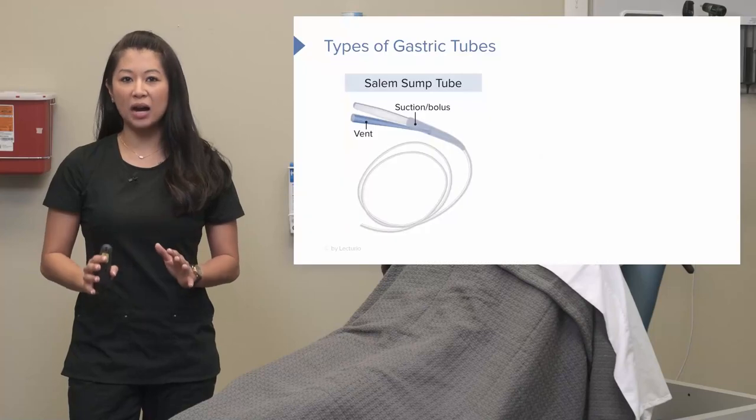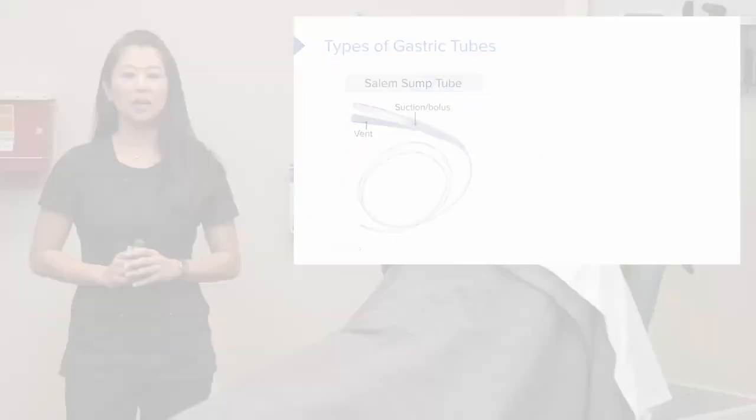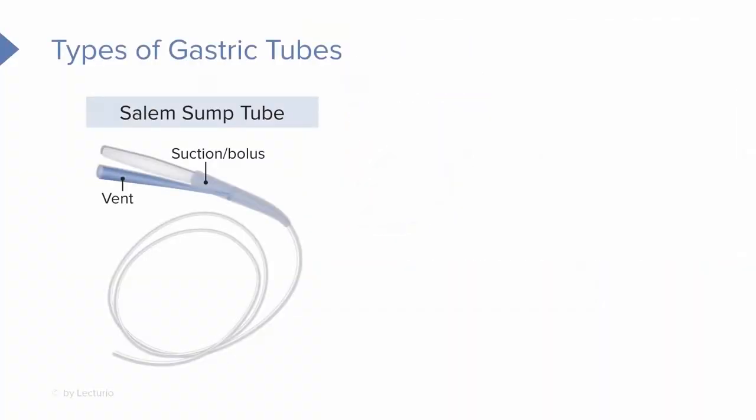Let's take a look at some common types of gastric tubes. The first one is commonly called a Salem Sump Tube. On this device, you can see there's a blue vent port, and also a suction or bolus port. The suction port is typically where we hook this to wall suction, or we can administer feedings and medications through here.